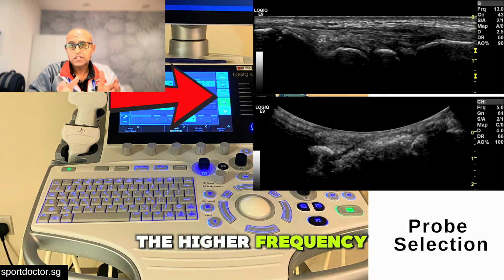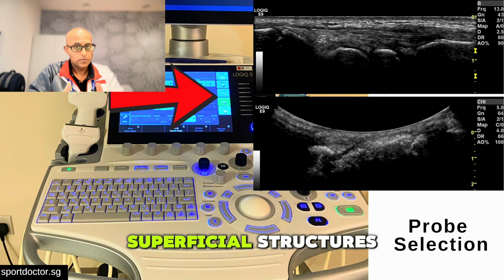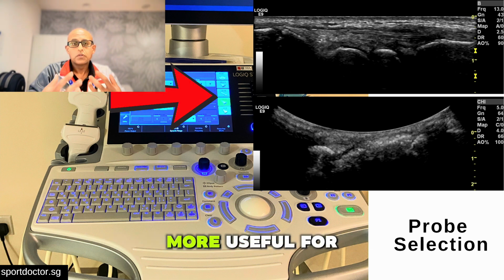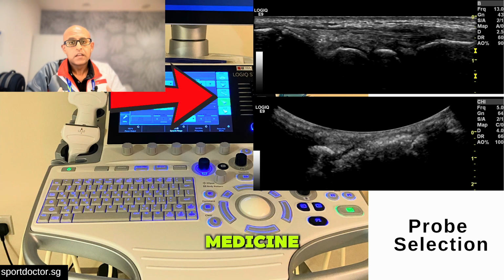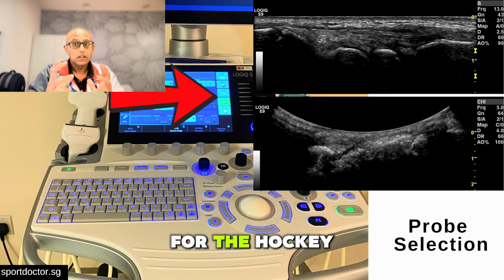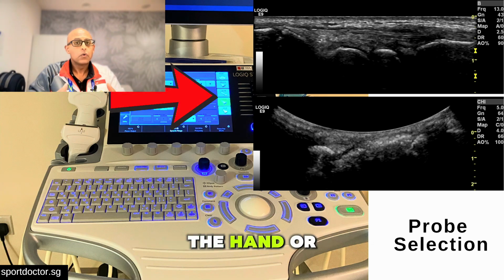The higher frequency, smaller hockey stick transducer is very useful for superficial structures, whereas the curvilinear low frequency transducer is more useful for deeper structures. In musculoskeletal medicine, this may be structures such as the hip or the spine, and in contrast, for the hockey stick transducer, you may look at structures around the hand or the feet.